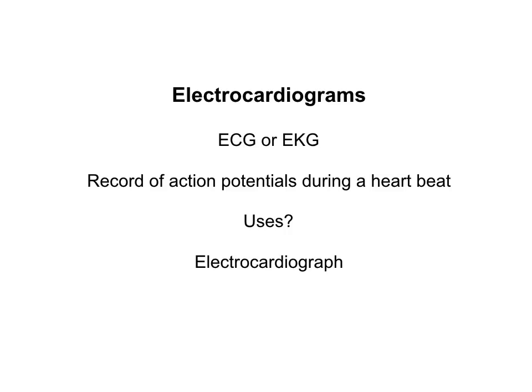There are many different uses for an electrocardiogram. You can use it to detect abnormalities in the conduction system. You can detect enlarged heart chambers. You can detect regions of heart damage. You could determine the cause of chest pain. You can even detect electrolyte and hormonal imbalances.